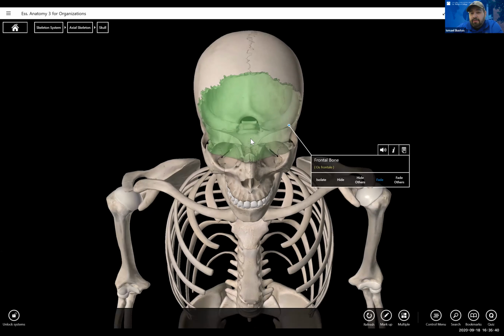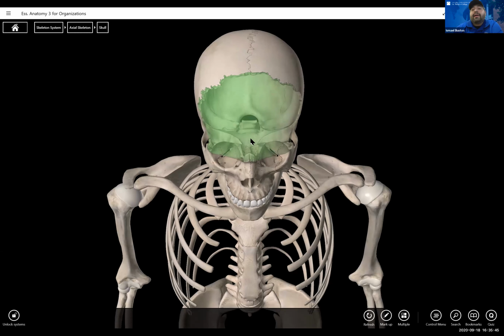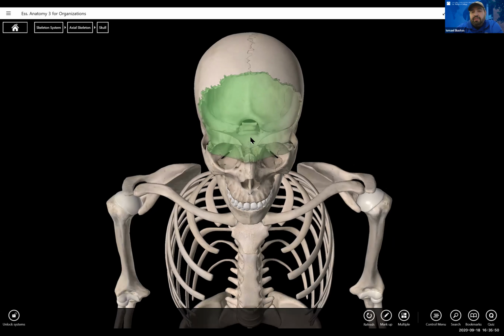Either you're not angled enough, so you decrease the angle, or you decided to extend your head. So you extend your head, you're bringing your head back, and that dorsum sellae goes above the foramen magnum. So, two ways that the dorsum sellae can be located superior to the foramen magnum is if there is not enough angle, or you had excessive extension, insufficient flexion. Excessive extension, not enough flexion. I'm trying to help you all visualize it here because it's going to be a lot to remember.